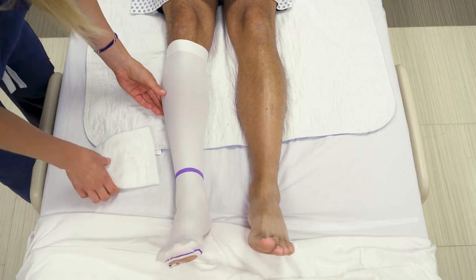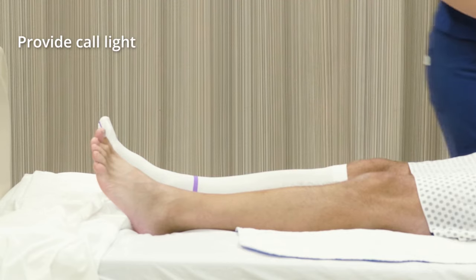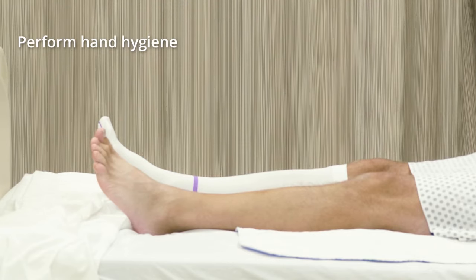Make sure the patient is comfortable and the bed is in a low position. Place a signaling device within reach and perform hand hygiene.